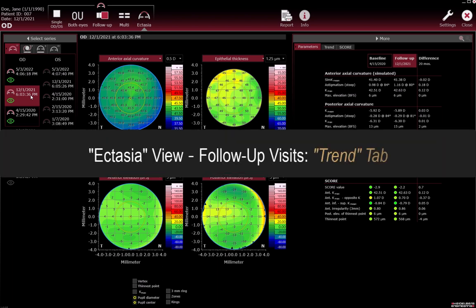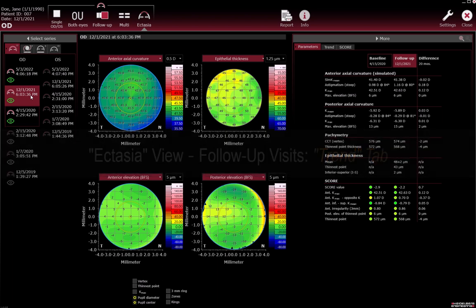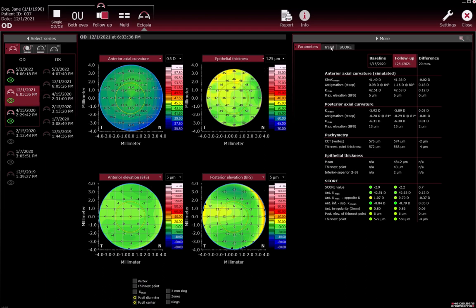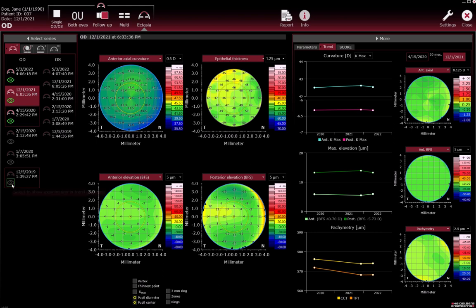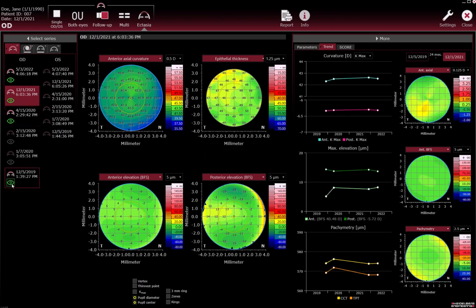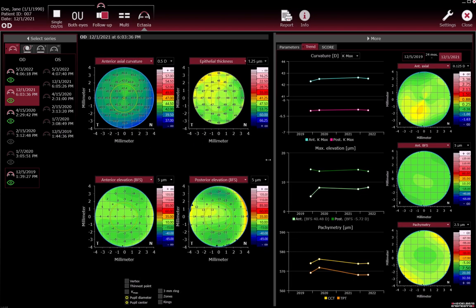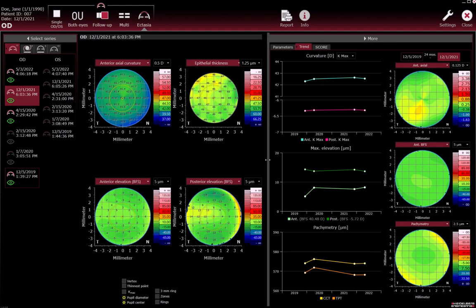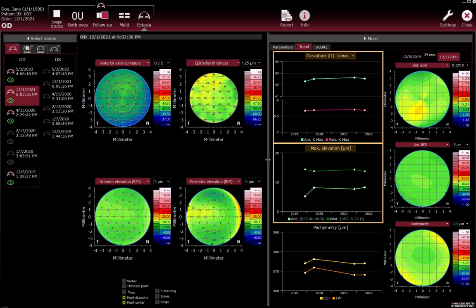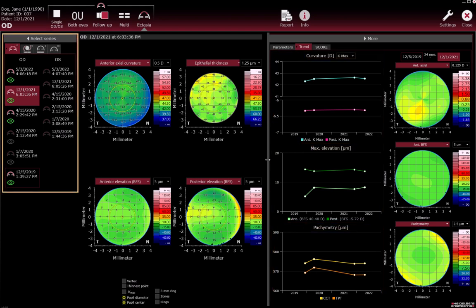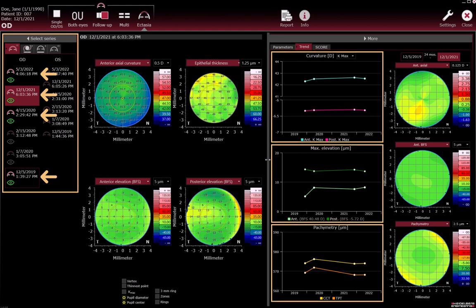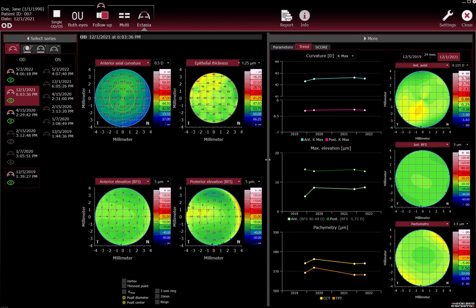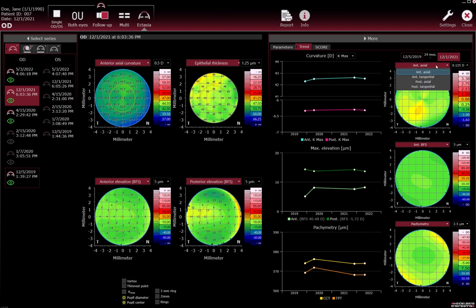Ectasia view follow-up visits — Trend tab. On the Trend tab, assess how the measurements have changed over time. The trend analysis graphs on the left show the change of measurements for the examinations selected in the Select Series section for curvature, maximum elevation, and pachymetry. All examinations marked with the green eye icon in the Select Series section are included in the trend analysis graphs. For each trend analysis graph, you will find a difference colour map that shows the differences between the follow-up and the baseline examination.